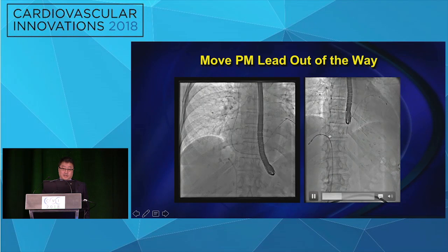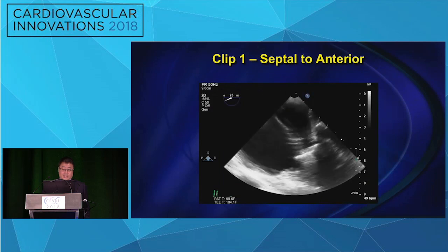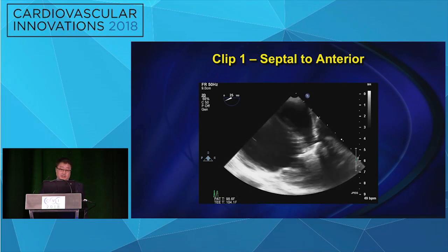Paul snared the pacemaker wire and pulled the slack down into the IVC to get that out of the way. And it's kind of like MitraClip once you get the right views. You just want to get the 2 leaflet pairs. You want to see the leaflets resting on the arms, and technically otherwise it's a similar grasp.